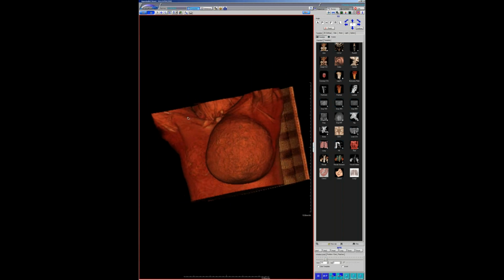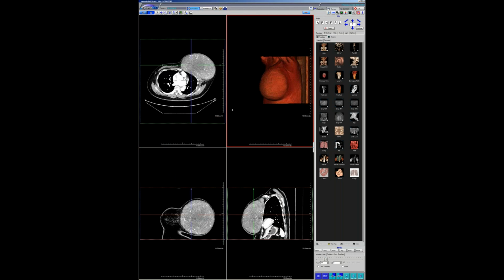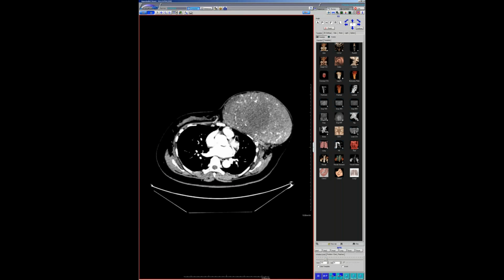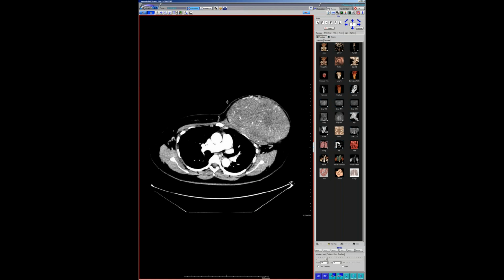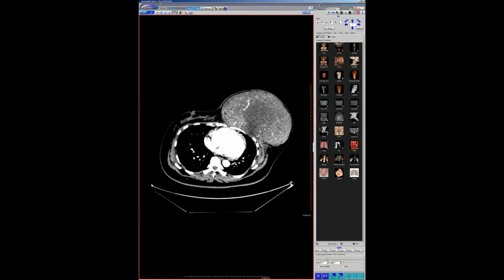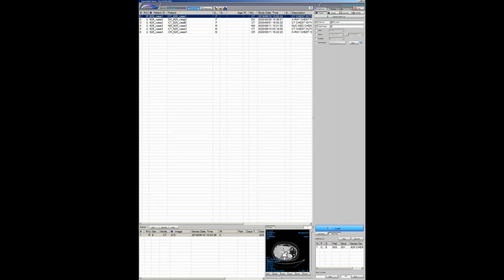size of these things. So anyways, just a really impressive case. I never realized how vascular these lesions were, these phyllodes tumors, but you can see how avidly enhancing it is, and these massive vessels just going throughout this big area of necrosis. So I thought that was an impressive case.